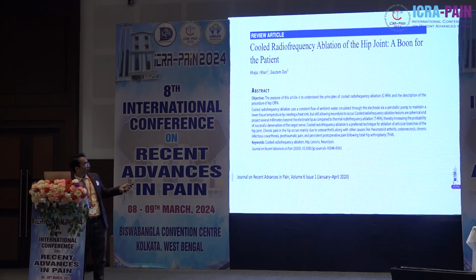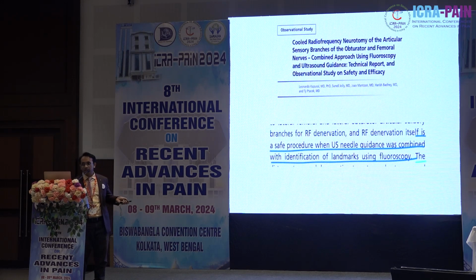Now, this is a review article from me and Tasar. We had written an article on cooled radiofrequency ablation of the hip joint, a boon for the patient, wherein we put across the technique and how useful it is for patients suffering from such chronic pain conditions. And again, this article also compares the combined, hybrid approach with fluoroscopy and ultrasound.